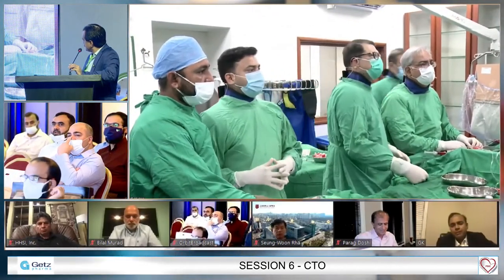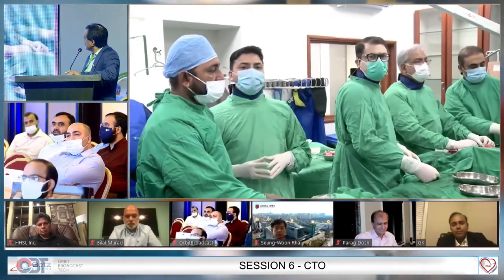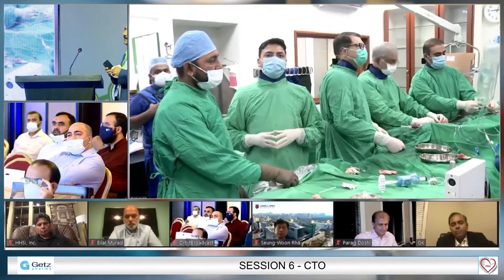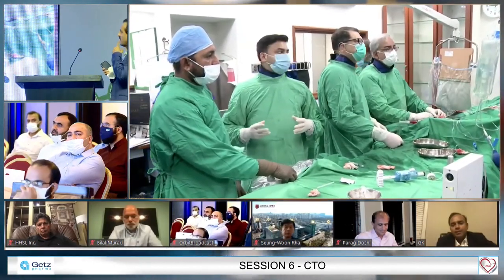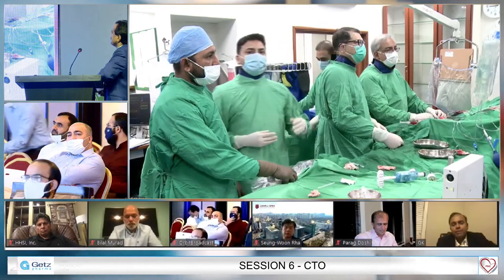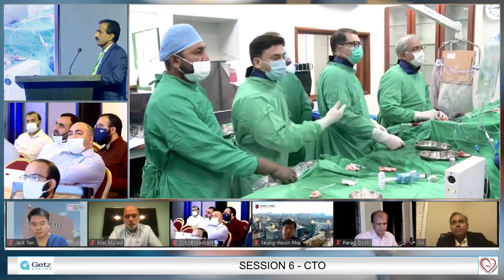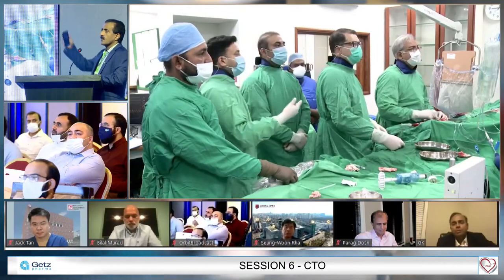Yeah, absolutely. While we have a second, feel free to cut me off anytime we go live. I think one of the most important things that I learned pretty early on, especially if you're having a perforation, is to really have a second guide catheter system to quickly come on up while you're holding tamponade with one system.